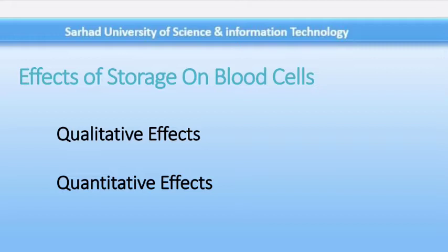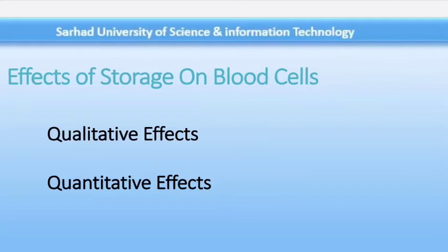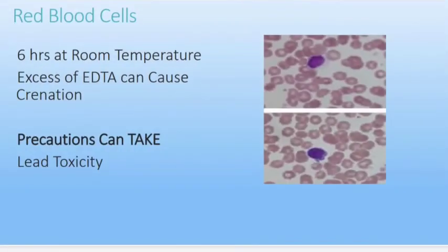Normal red cells are little affected by standing for up to six hours at room temperature. Longer periods lead to progressive crenation in the morphology of the red blood cell, and some sphering is also observed. In the presence of EDTA, a marked degree of crenation can occur within a few hours. All the above changes are retarded but not abolished in blood kept at four degrees centigrade.